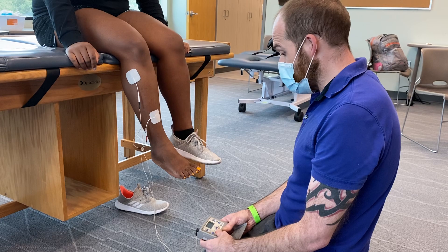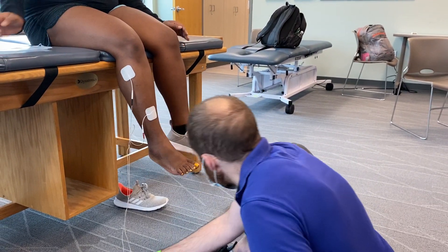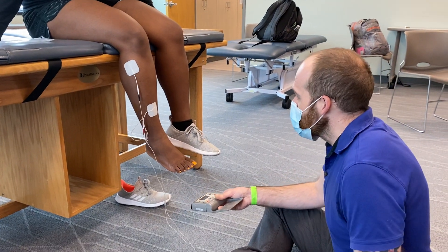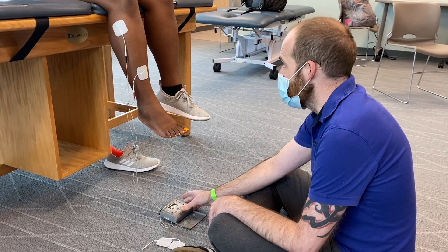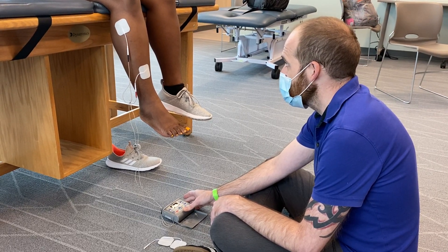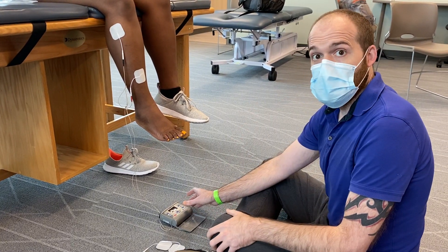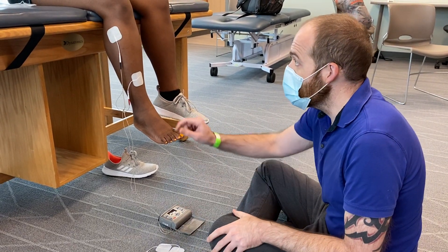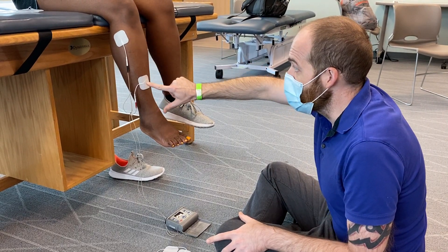This is the rest time — we didn't turn it off. There's a rest time built in, so let's sit here for one more cycle to make sure it's pure dorsiflexion. It's about a 50-second off time. If you're getting too much eversion, that means your pads are too far to the side — you need to put them more on the front of the leg.